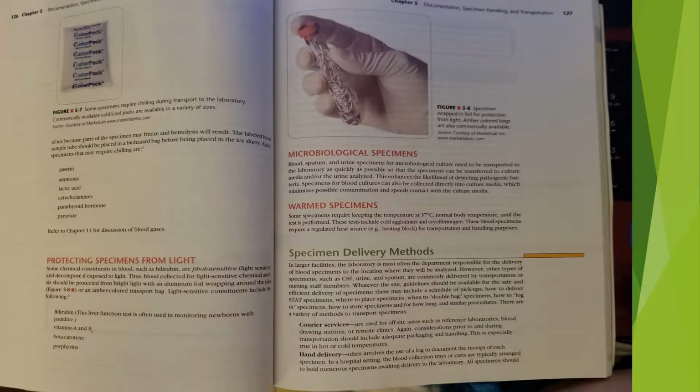Microbiological specimens. Blood, sputum, and urine specimens for microbiological culture need to be transported to the laboratory as quickly as possible so that the specimen can be transferred to culture media and/or the urine analyzed. This enhances the likelihood of detecting pathogenic bacteria. Specimens for blood cultures can also be collected directly into the culture media, which minimizes possible contamination and speeds contact with the culture media.